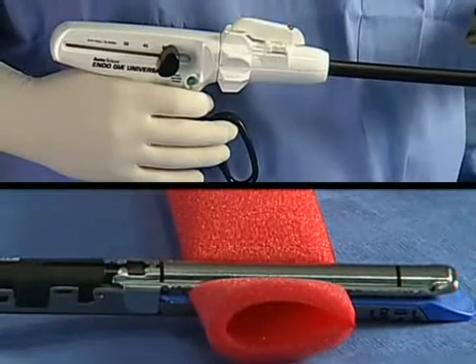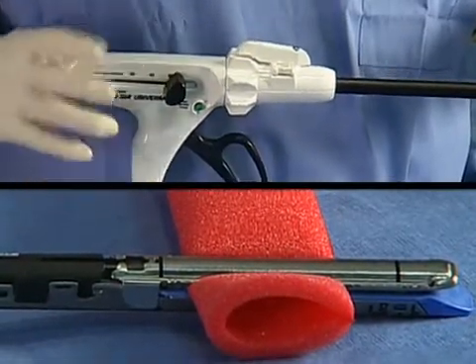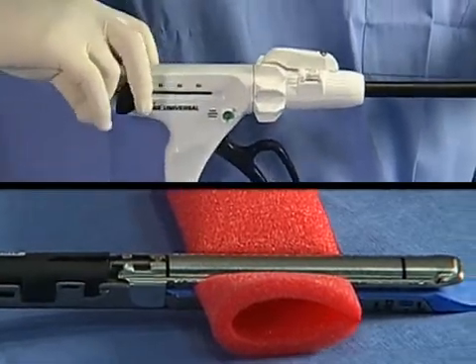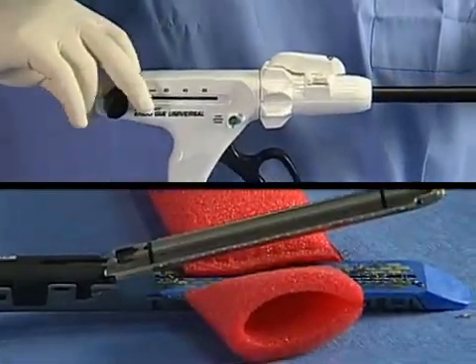As the stapler is fired, it places two triple staggered rows of titanium staples and simultaneously divides the tissue between the two rows. Once the instrument has been fully fired, open the jaws by pulling the black return knobs back to their original position and then gently remove the instrument from the tissue.